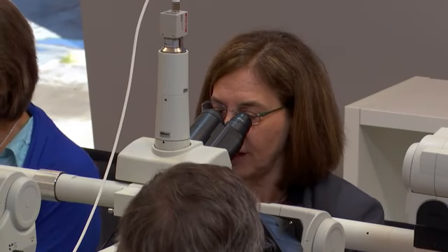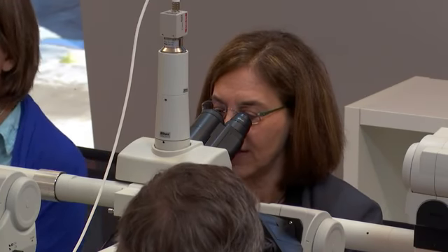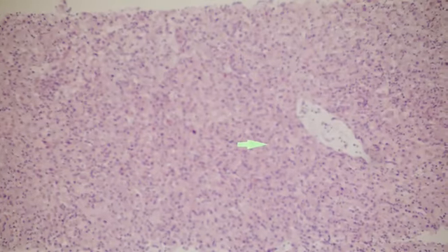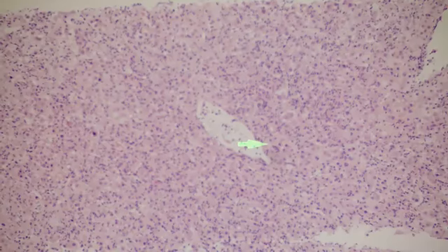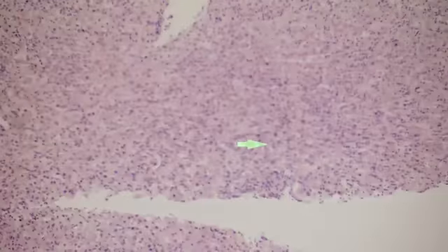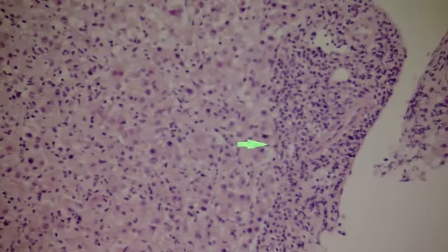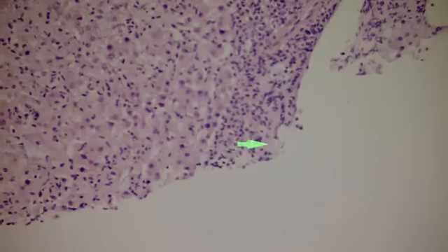But this is another acute hepatitis. So again, that should be what everybody thinks when they look at this case. This is absolutely acute hepatitis. Where's the action? It's everywhere. And what is it? It's kind of mixed inflammation. It's in the sinusoids. It's in the portal areas, right? There's interface activity a little bit, but that's not the primary pattern.